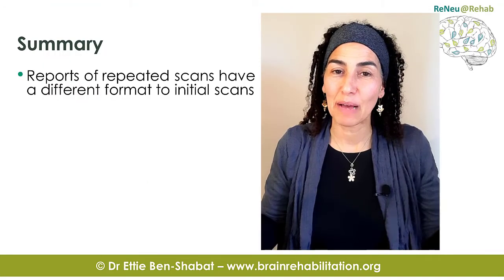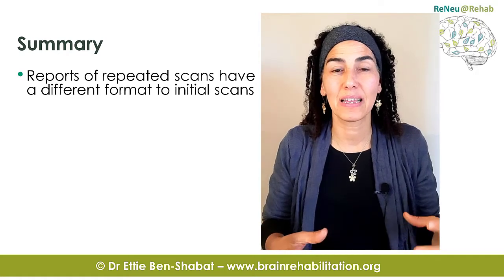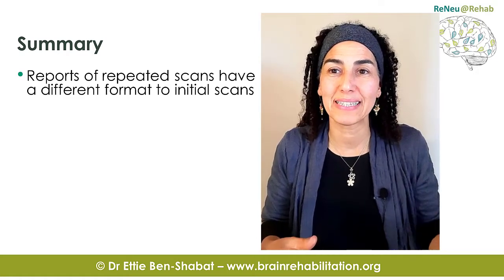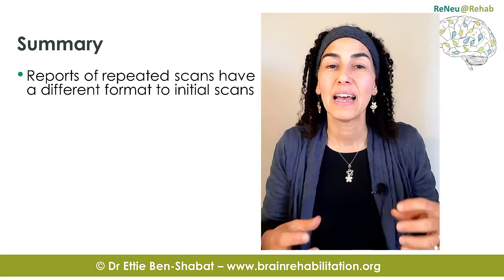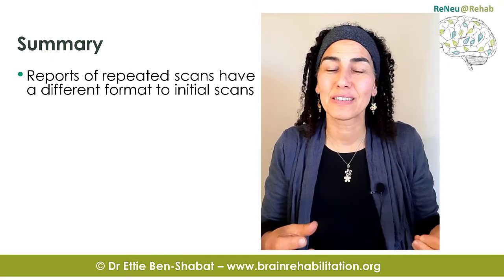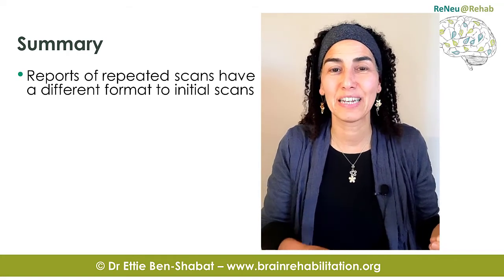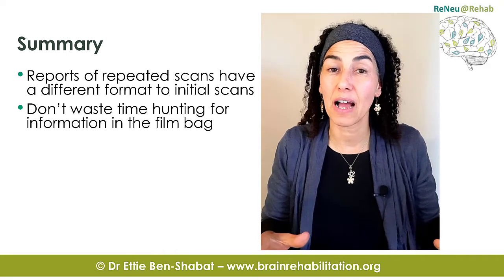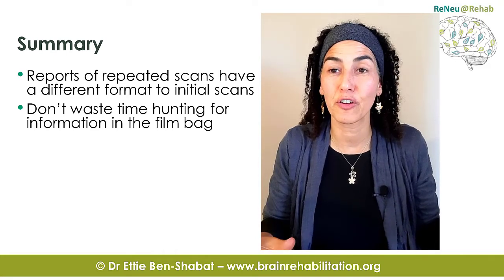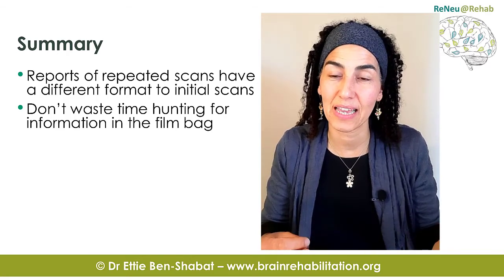So now let's summarize everything that we covered in this video. We talked about the reports of the repeated scans, and we talked about how they're different from the initial scans. And the reason for that difference, because the clinical question that was the basis of the scan is different from scan to scan. Then we talked about not wasting time hunting for information in the film bag, but using more of a targeted approach to the information you're seeking.